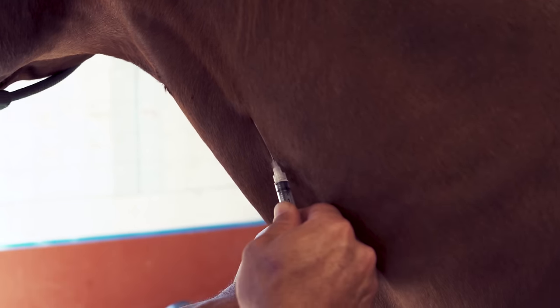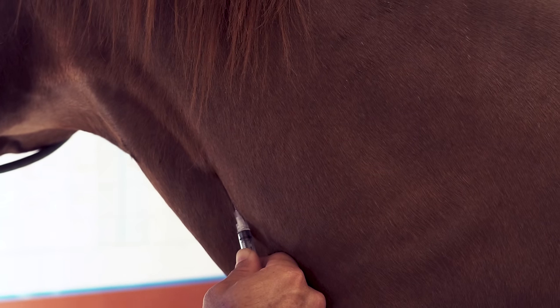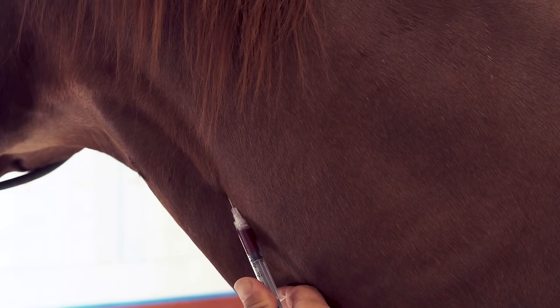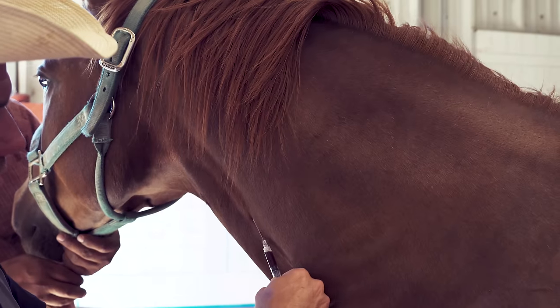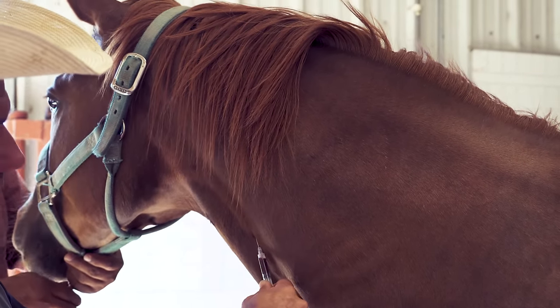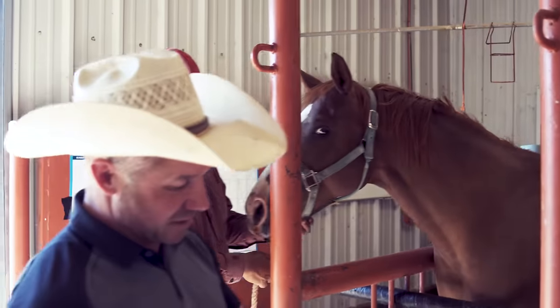See how I'm pushing a little pressure on it? Give it a 2 or 3 second count. Don't rush it. What it does is it kind of confuses those nerves, and then you just slide it right in there. Then pull back, and you've got blood. See how easy that was? The trick is, people like to poke it. Don't poke it, push it on there and hold it. It confuses those nerves, and then it slides right in, and you pull blood out. Simple as that. Just a little handy tip from somebody that's done that a million times.